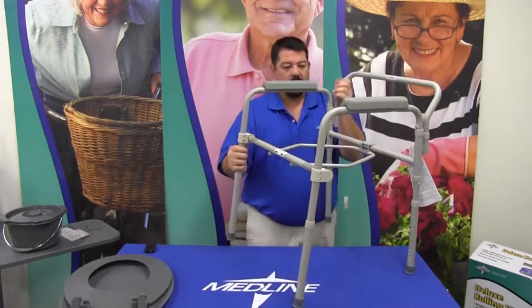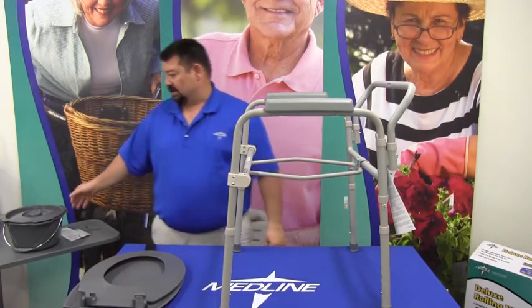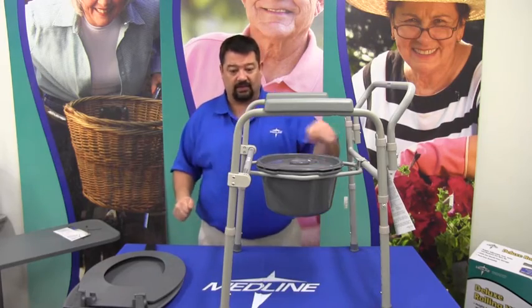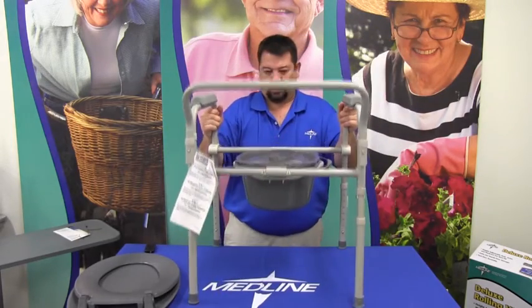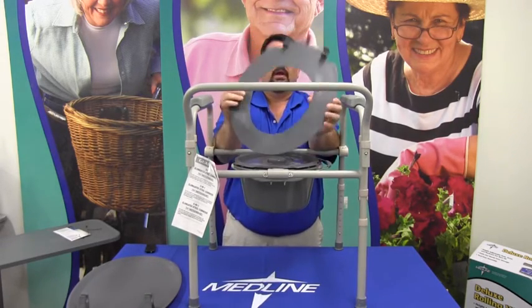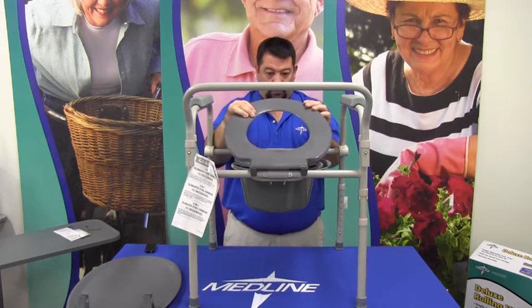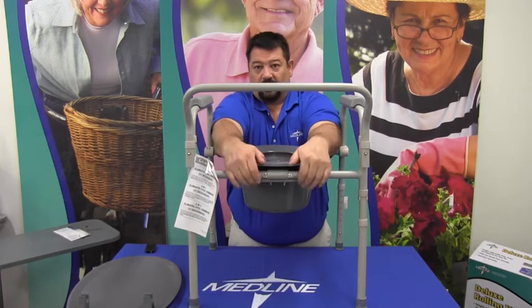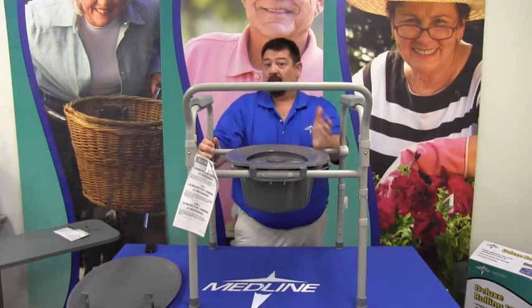Once this is assembled, the seat, the lid, and the bucket will all be placed inside the commode — they'll fit inside that chevron area. The seat has a set of clips that you can see right here, and they snap onto the rail that goes across the back side. Simply center it, squeeze down, and it clamps onto the back side of the rail — that's all there is to it.